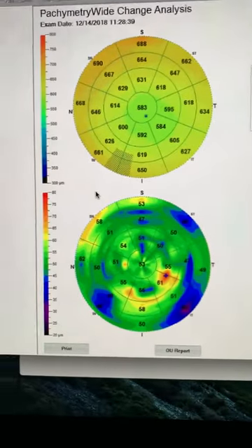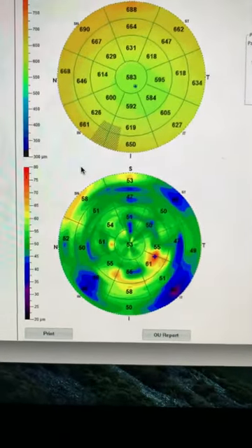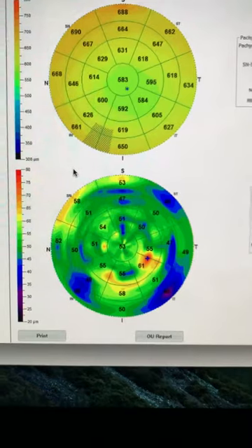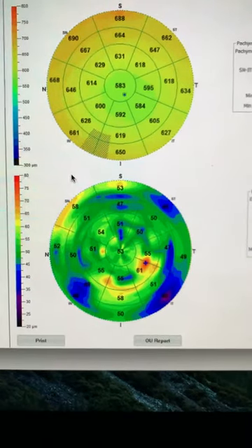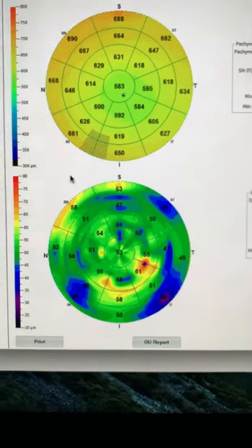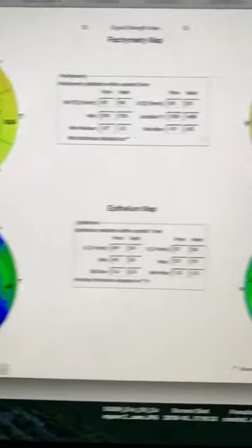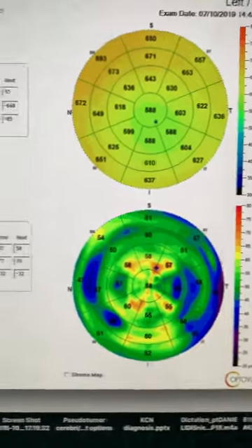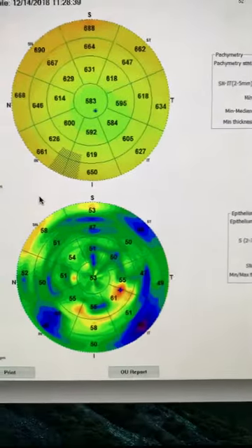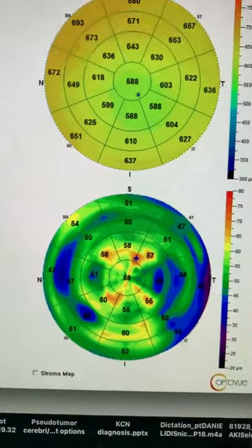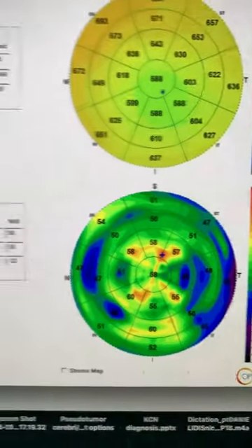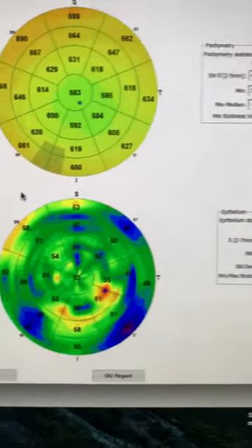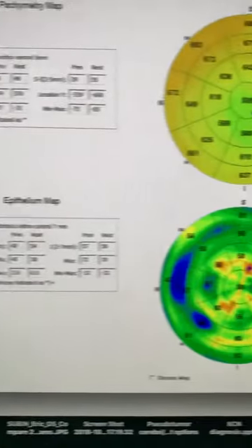Despite the stability in the epithelial maps, she has seen an improvement being hyperopic at the time post-PTK. This is the left eye — September 2018 and today, July 2019. There is no significant change in the epithelium.